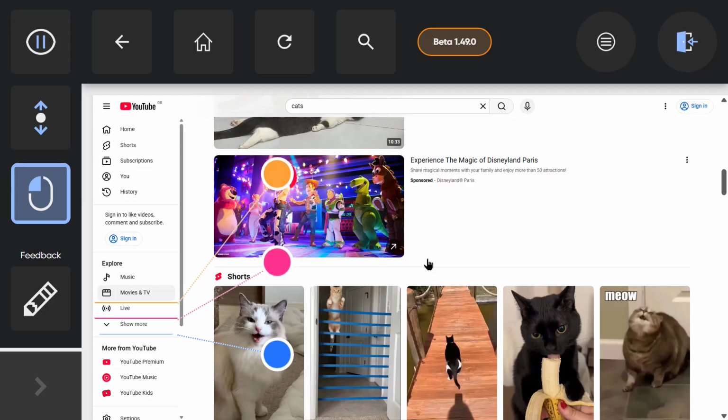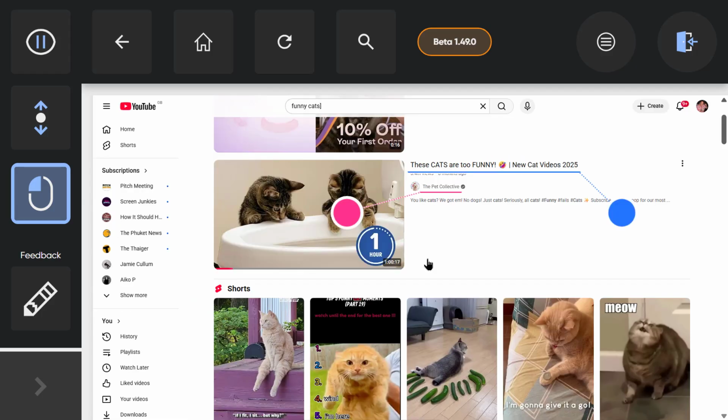but when it comes to navigating the screen content and YouTube, you have the coloured call-outs that you can see there in orange, pink and blue that you would have within TD Browse. And again, you just have those simple choices in terms of actions, mainly it's scroll up and scroll down and doing your clicking. So you'll see here me choosing a video.